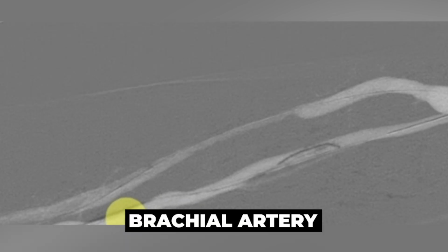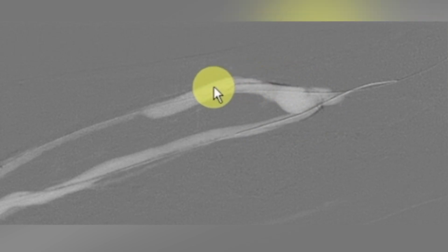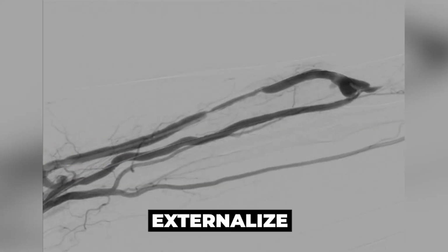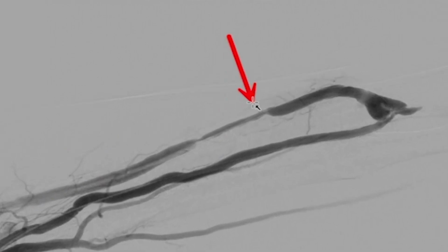What we did was to get a wire from the brachial artery going down, and we were able to get this wire across the arterial anastomosis into the cephalic vein, as you can see here. We were able to snare that wire from the cephalic vein and externalize it. At this point, we had a wire going from the brachial artery down the radial artery through the arterial anastomosis and into the cephalic vein. This is just essentially spasm from the artery, so we're not worried about that.